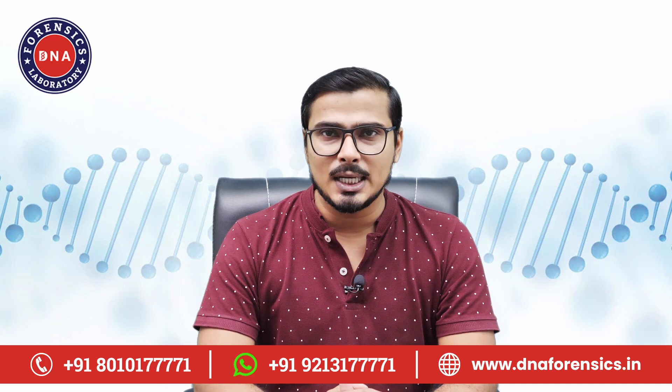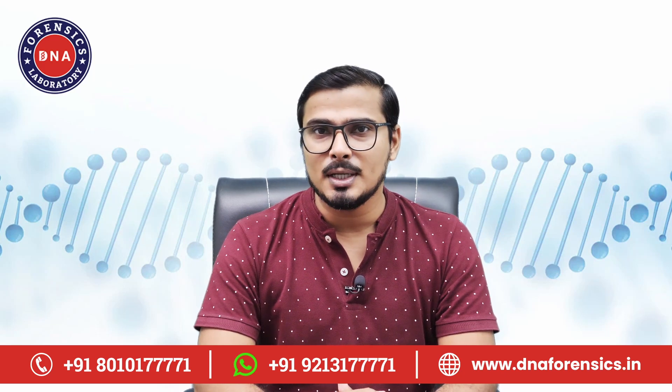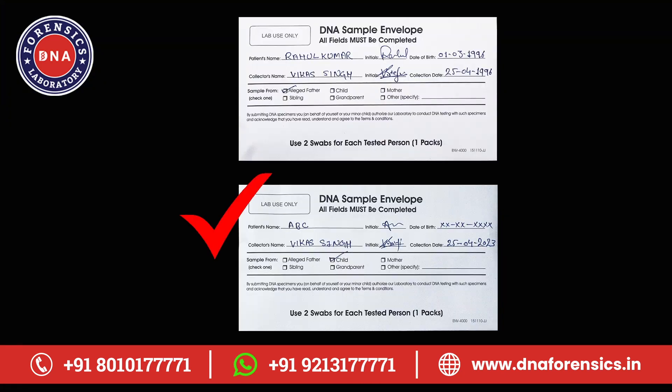Repeat this process for all the tested persons. To give you an example of a real life case, we have already prepared a dummy envelope of another tested person's sample whose DNA is to be matched with the other tested person.